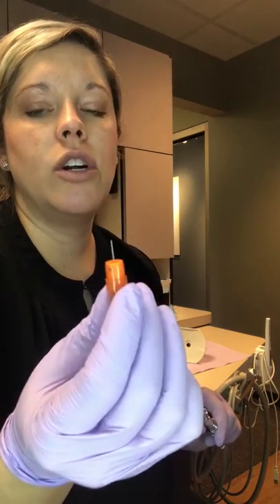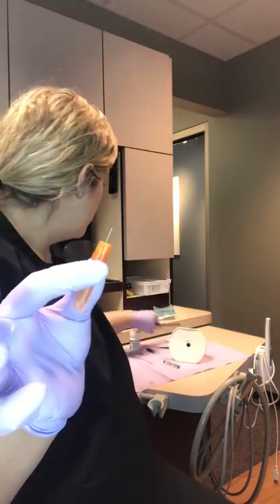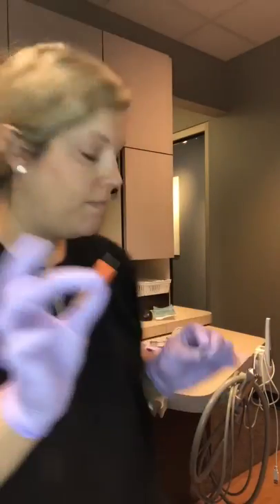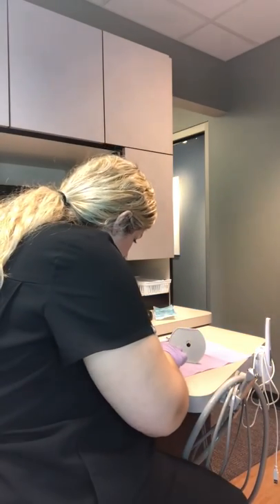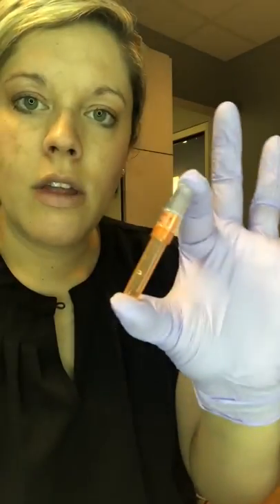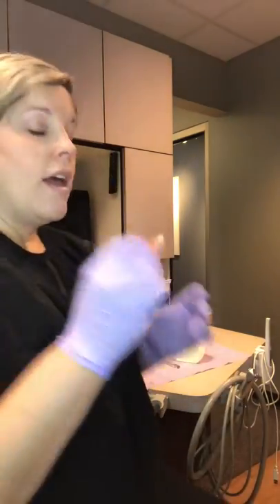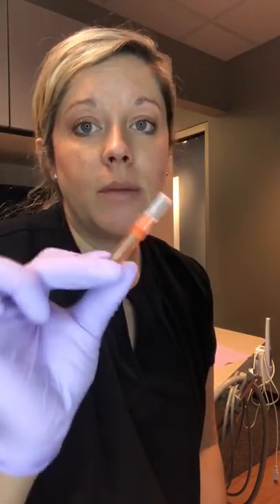This can be inserted directly into a sharps container if you have those in each operatory. If you do not, you can use the cap to recap it using the scoop method. That is to ensure safety so that nobody gets stuck. This whole thing is going to go into the sharps container.